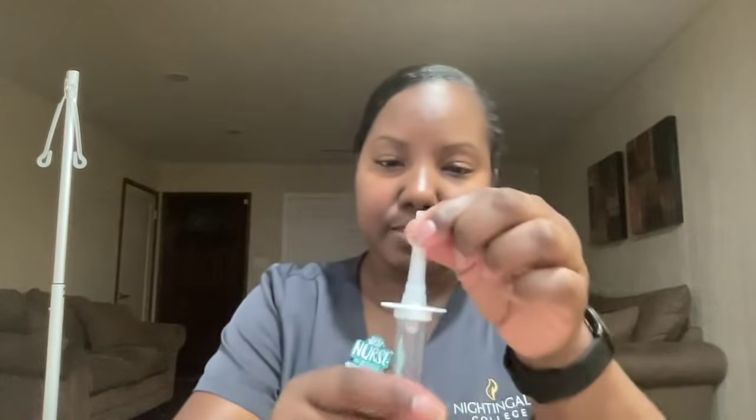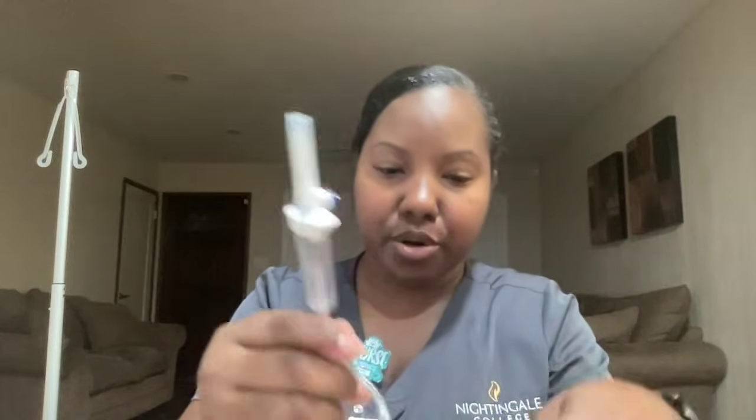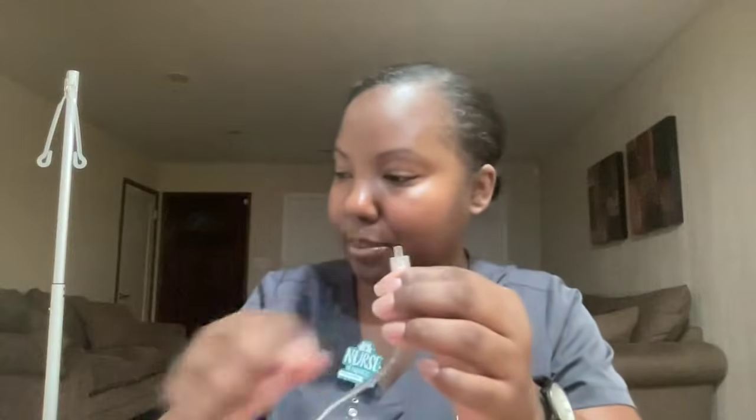The secondary tubing is very similar. You have your spike end, you have your drip chamber, you have your roller clamp, and you have your adapter end. This adapter end will be connected to the Y port of the primary line.